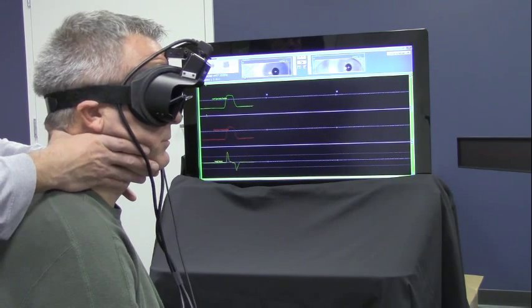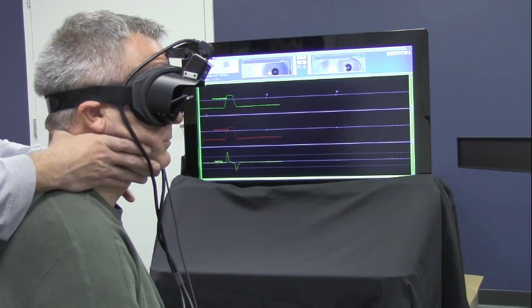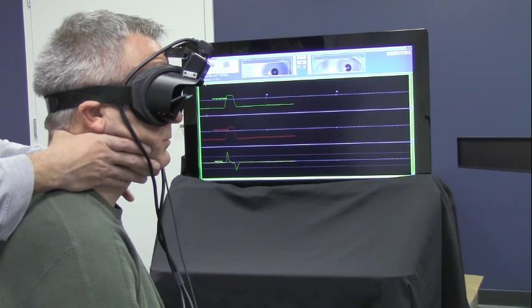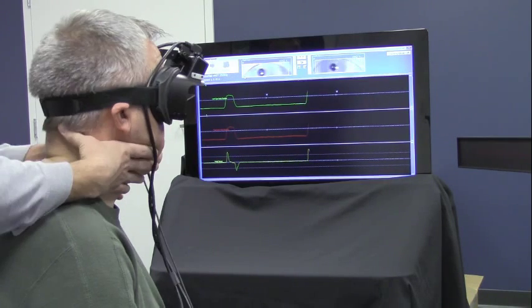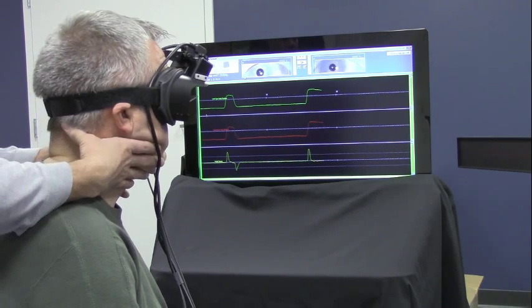It is recommended that you randomize the head thrusts so the patient does not anticipate.